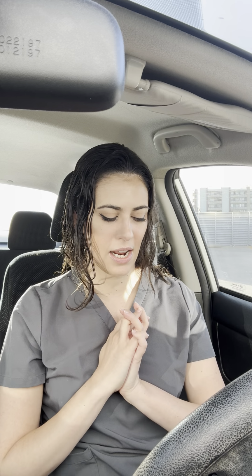I can't remember what it's called right now, but it jets into the trachea, and it has this pinch valve, so it pinches it off every so frequently based on the inspiratory time and the rate, and that allows this passive expiration. So it's jetting down. The highest pressure is going to be right at the end of the endotracheal tube, and as we get to the distal airways, the pressure is actually a little bit lower. And in between, with the pinch valve, there's this passive expiration.